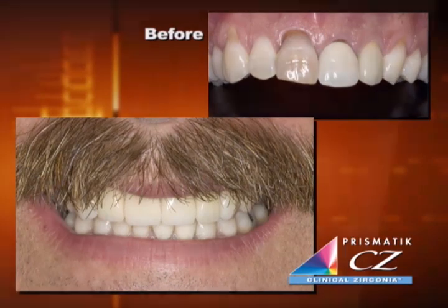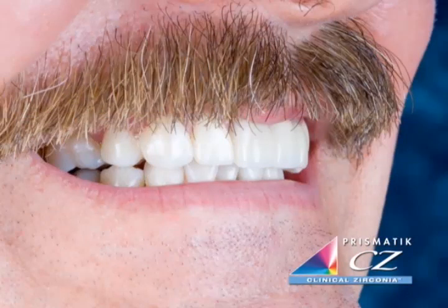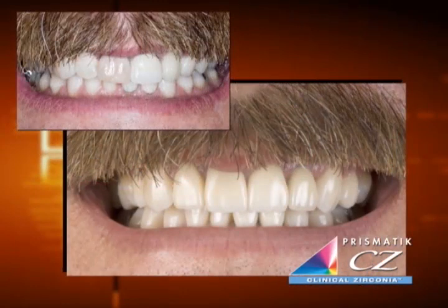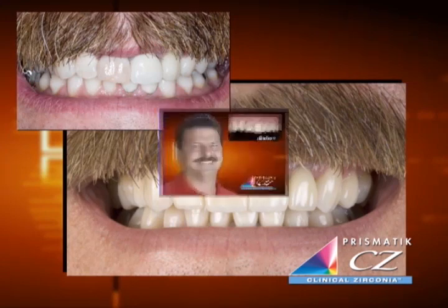In the old days, this would have been a difficult case to do because we would have been faced with either, you know, prepping veneers on those other teeth or prepping full crowns on those other teeth. And it's really nice to be able to round out a smile and do some additional aesthetic dentistry for the patient, really complete the smile and be able to do it without preparations, without shots, and without temporaries. And you can see Jeff's smile afterwards. It's a much better smile than he had before. He's got some confidence in his smile now because he's got some great looking restorations.